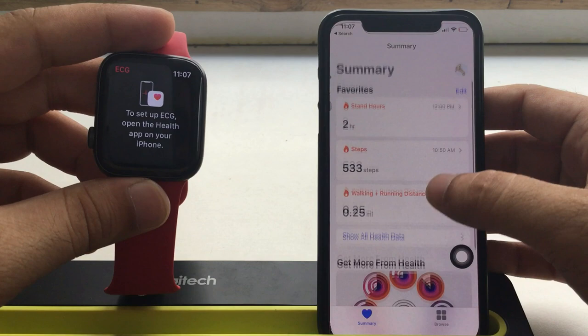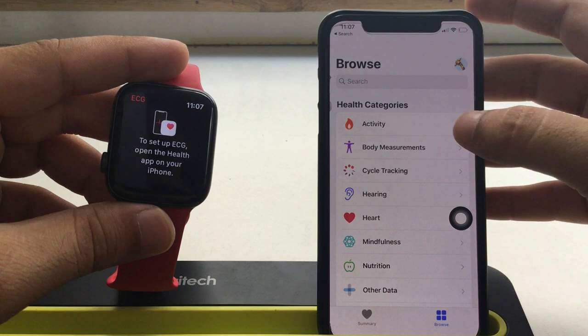On your iPhone, open the health app and find electrocardiograms ECG from the bottom browse tab or find under the heart option. In the search field, type ECG.